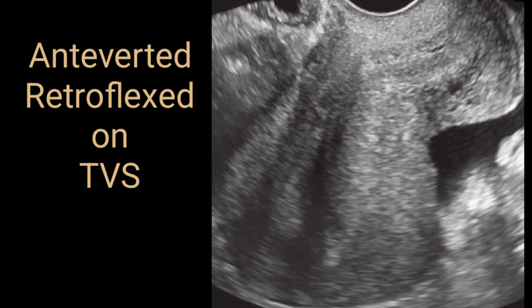This is another transvaginal scan. On this scan you can see that the uterus position is anteverted. So as far as version is concerned, it is anteverted, although you cannot see the bladder clearly, because for a transvaginal scan you need to have an empty bladder. Therefore, in respect to the bladder you can't comment on that. But as far as the other areas are concerned, it is quite clearly visible.